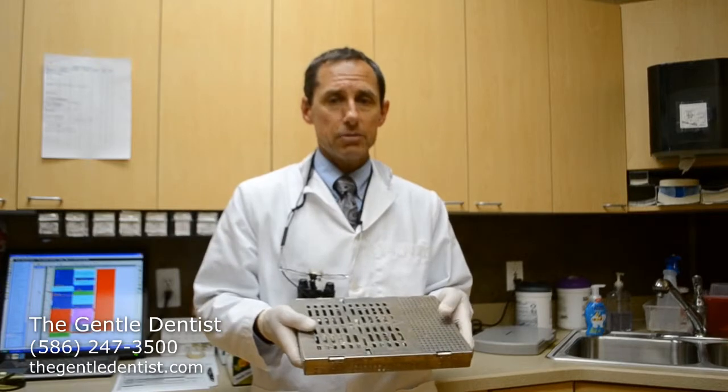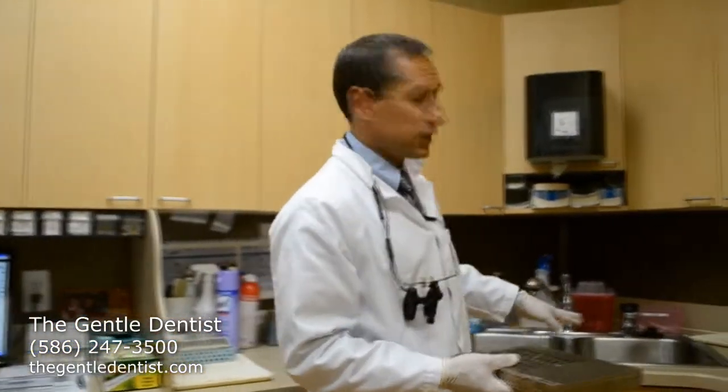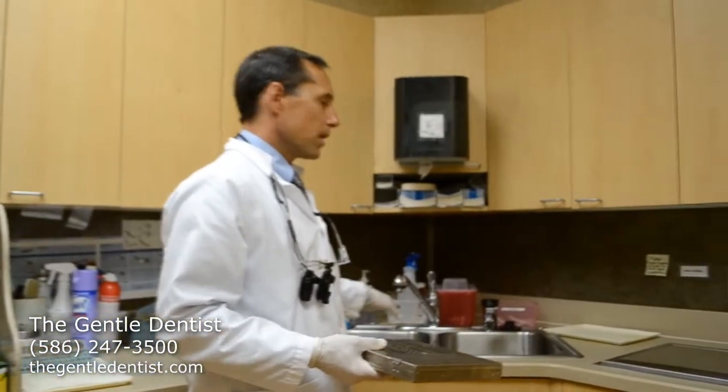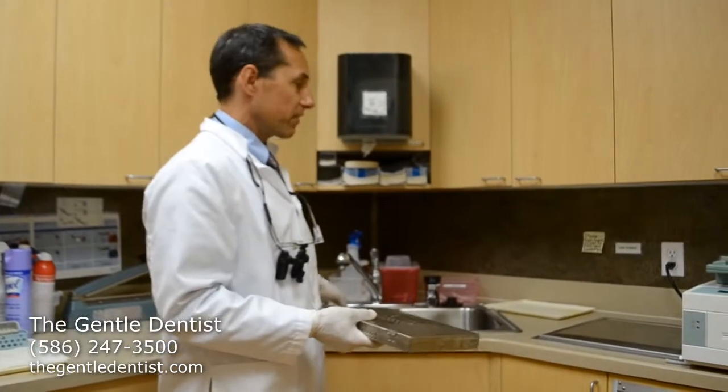Let's say somebody gets done with a procedure in the office, and then they leave. What happens after that behind the scenes? First of all, we take these instruments and bring them in here, and if they need to be cleaned, we use this to wash off the excess material that's on there.